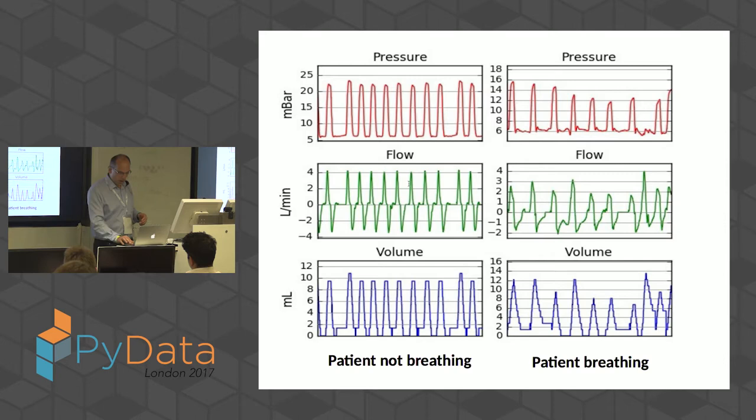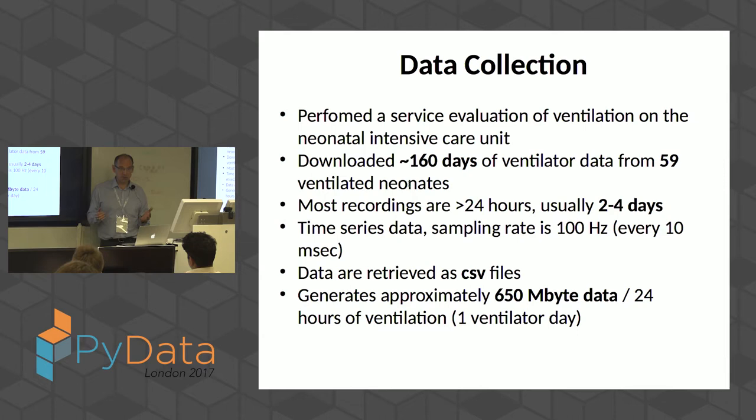So I thought it would be interesting to see what's happening over longer terms, during mechanical ventilation in these babies who are actually breathing spontaneously. Initially starting as a service evaluation of the alarm activity of these ventilators, I've downloaded approximately 160 days' worth of ventilator data with a 100 hertz sampling rate. It's time series data with one data point every 10 milliseconds.